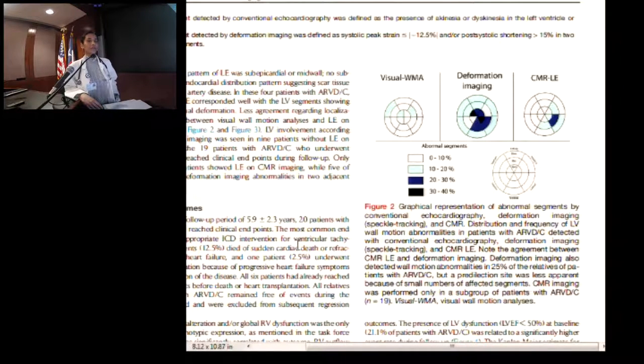Don't you acquire the 4 chamber, right? Yeah, and it overlays your strain on the 4 chamber. No, you said this is all post-processing. You can correct it. Yeah, that's correct. What he's saying is you're the one who goes back and puts your region, depending on how big, how small the location. Yeah, 4 segments. But that just may be the way the software does it.